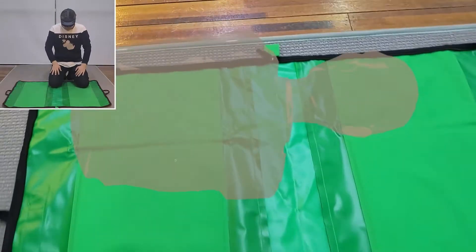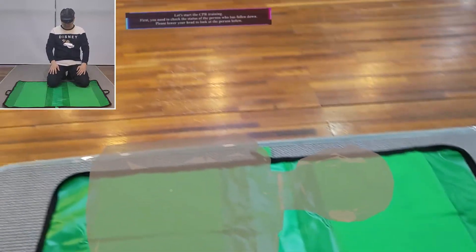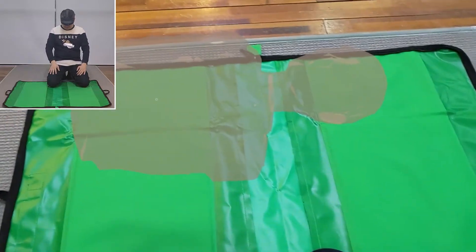Let's start the CPR training. First, you need to check the status of the person who has fallen down.